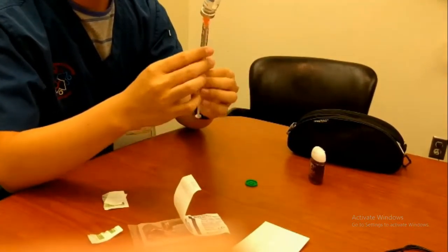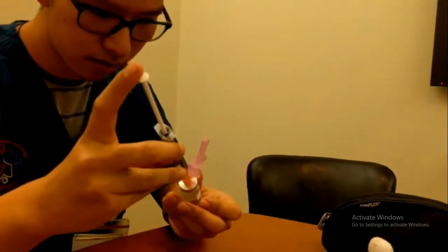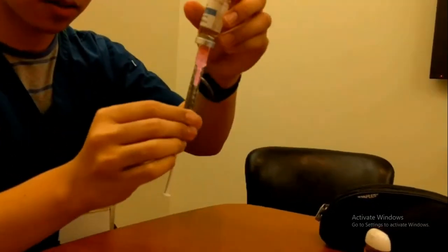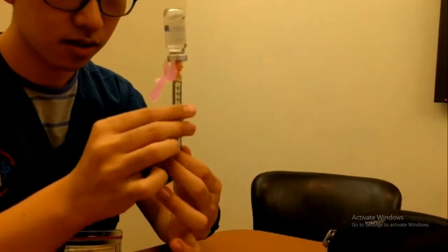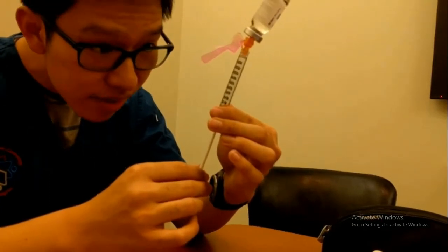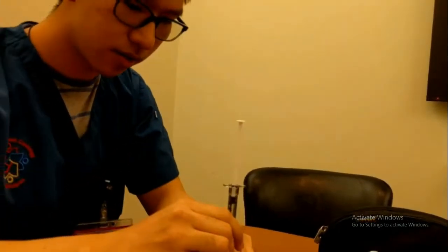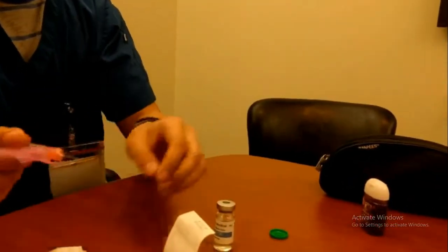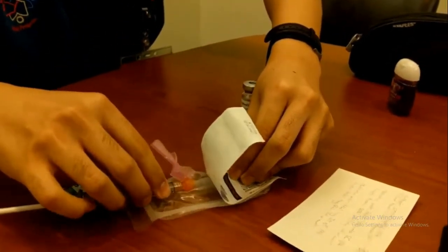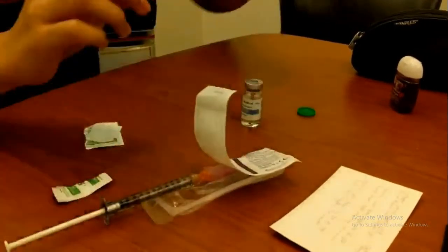Now I'm going to be just flicking. And okay, so now I'll be expelling the air bubble. Then I'll just be aspirating the rest of the 1 ml because of the liquid that I have expelled. There we go. Alright, so that's fine. So I'm going to turn it back over, take it out, and put it back into the cap. There we go. And also the safety lock. And just lock.